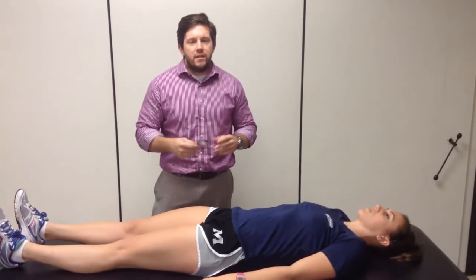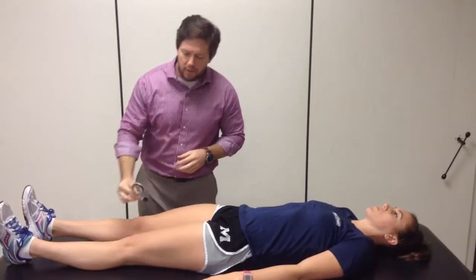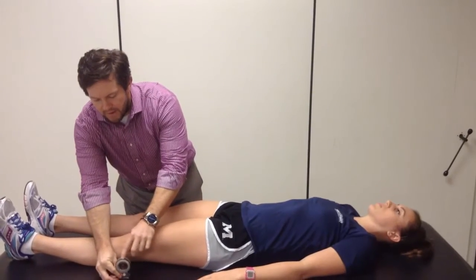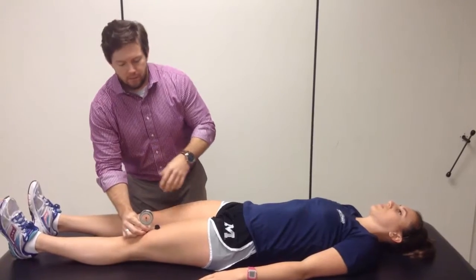In this video we're looking at hip flexion. It's stuff that you've already seen before, but we're just going to try to make it a little bit more reliable. Your measurement using the bubble inclinometer — you're still going to go through and zero it out on a flat surface, preferably the table, and then you're just going to come on to the patient.